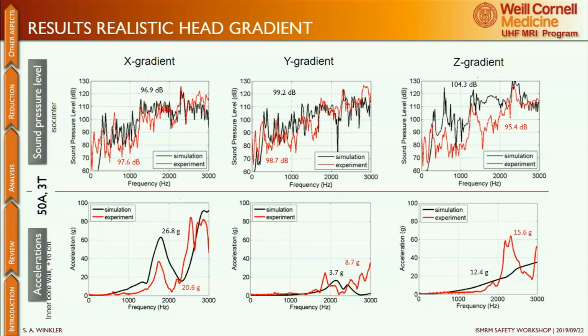And in addition, what we also observe is that in the head gradient insert, some of these modes are shifted to higher frequencies because the gradient is smaller. So for example, the 011 mode here is actually at a lot higher frequency for the head gradient insert. So if you look at the band of frequency of interest for RF pulses, you might even shift some of these modes outside the spectrum and can operate a little more quietly. So short is good. This is the experiment.